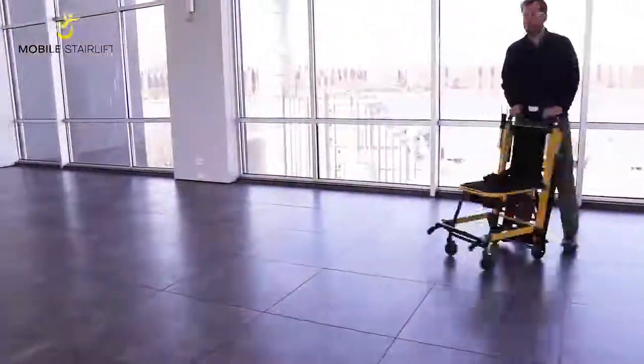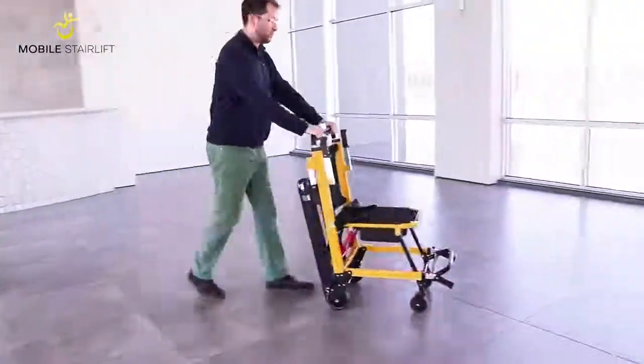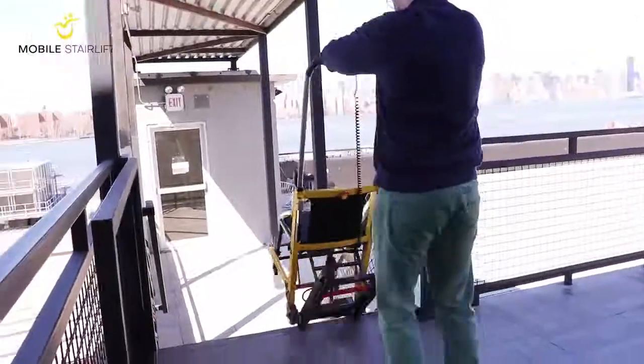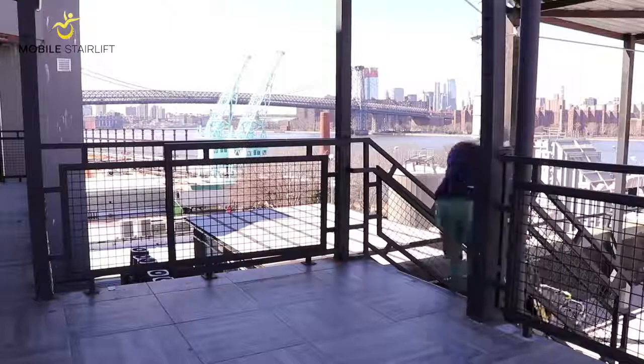We recommend familiarizing yourself with the stair lift by practicing on flat ground, then ascending and descending stairs with no rider. This will ensure your safety and the safety of the rider.